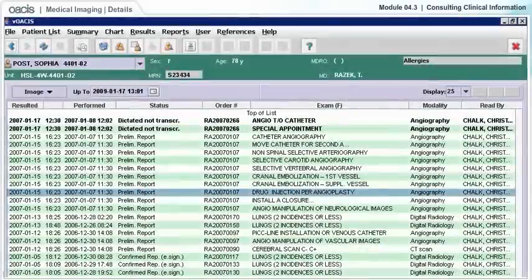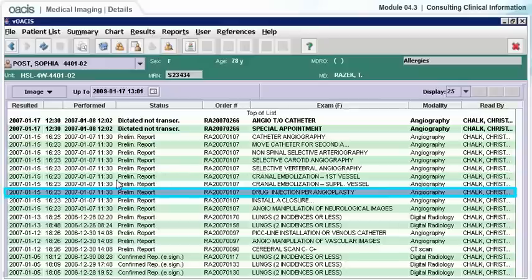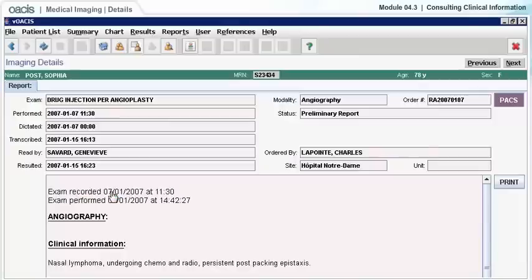Click on the highlighted test to access the report. The detail screen shows the report and some additional information, as well as a link to the PACS, a viewing application to display selected images.